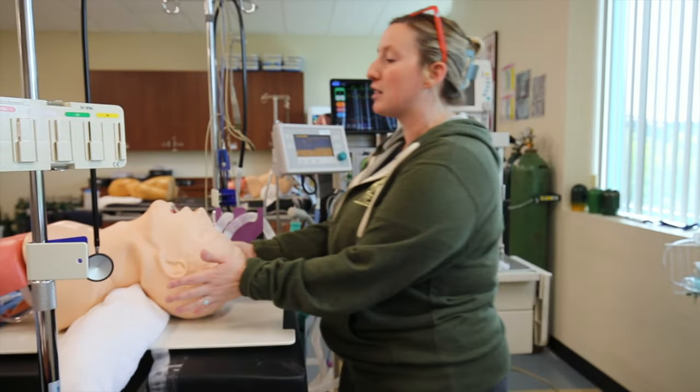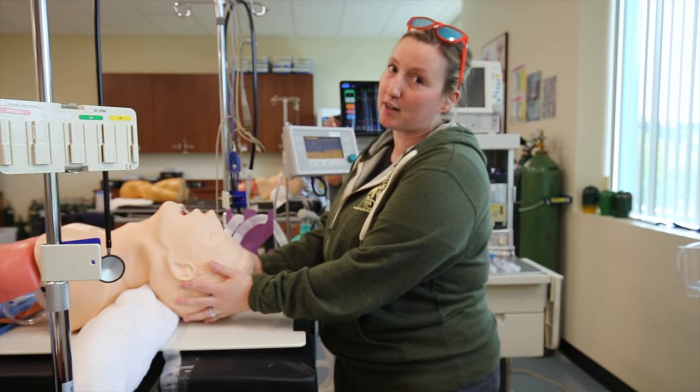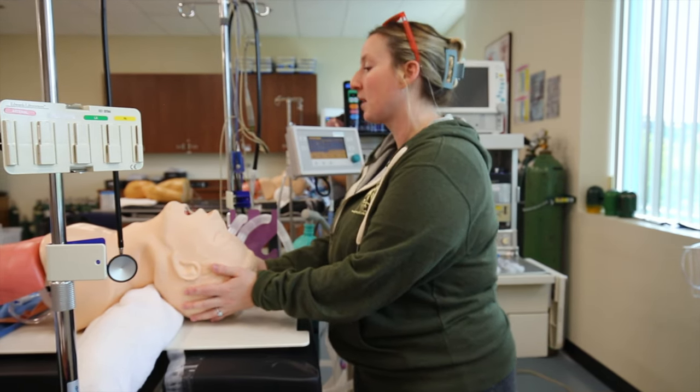For this patient, they're having a lap chole, so I'd make sure that I have an OG tube for them. I have a bear hugger and a nerve stimulator.